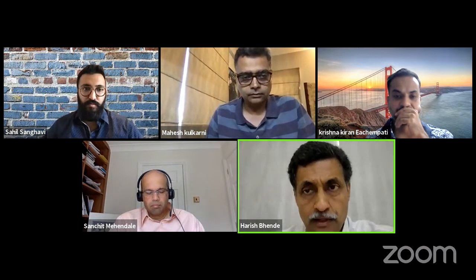So all these things have to be assessed during the surgery. And as I said, we are normally used to one type of implant from X or Y or Z company. But during the surgery, not all companies provide all options. And you have to be conscious in taking a decision whether I want to use some different type of implant so that you can change the company, maybe just for that case, because you don't have options in the company which you use.